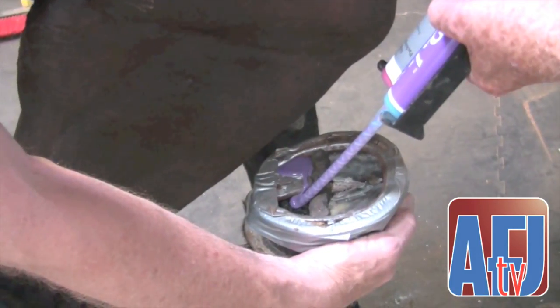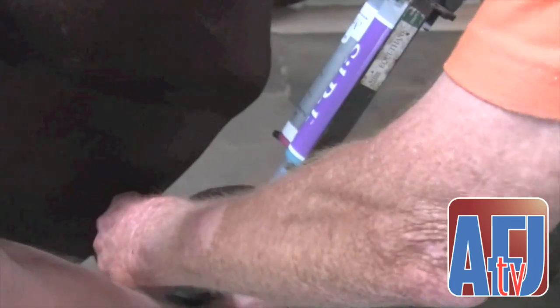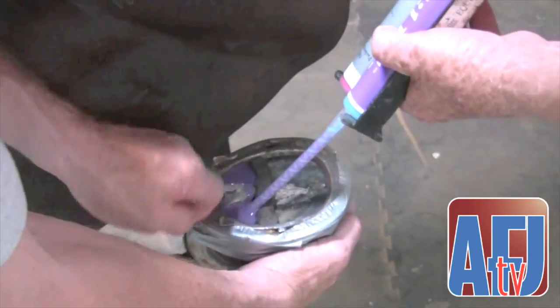I like this Vet Tech product because it has the ability to support weight, but it still gives the horse some cushioning. I understand there's a discrepancy between support and cushioning material, but in this application I can get support as well as a little cushioning and still get the weight distribution I wanted.